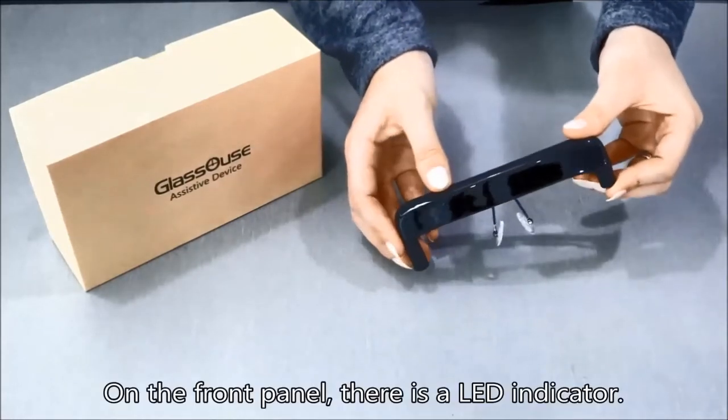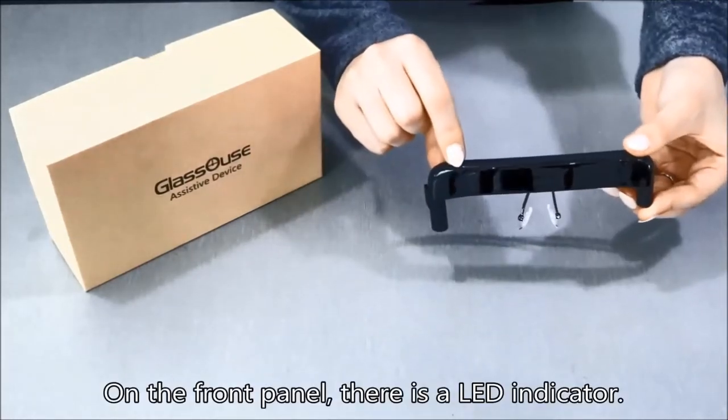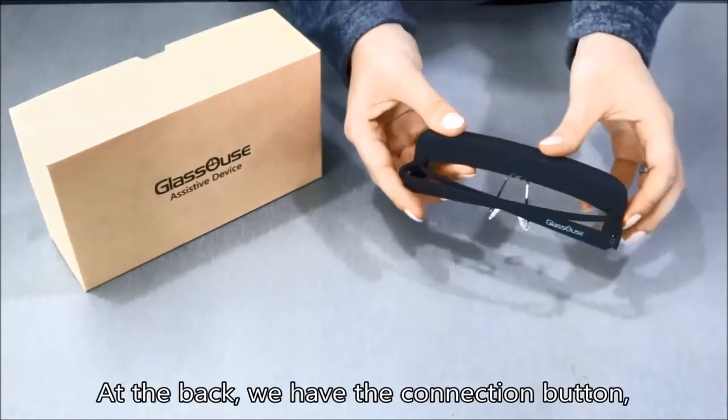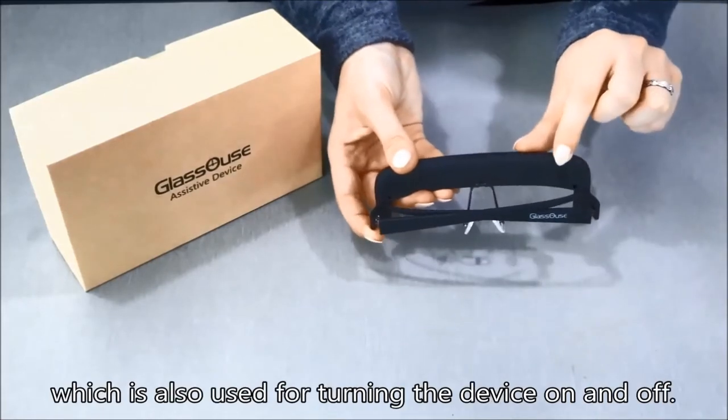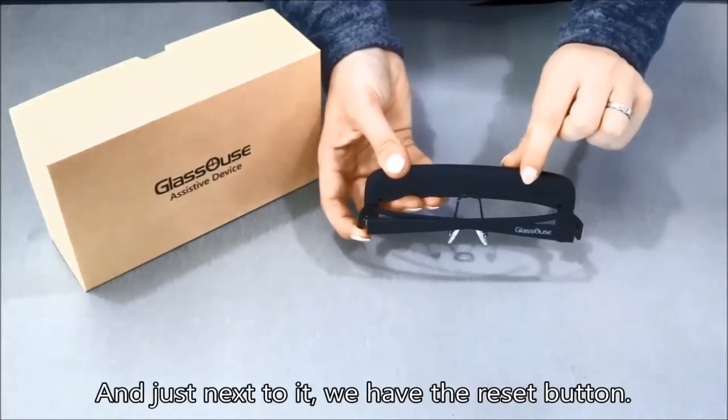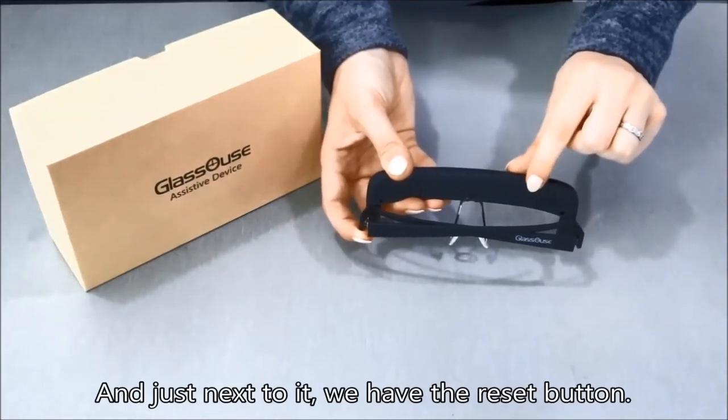On the front panel there is an LED indicator. At the back we have the connection button, which is also used for turning the device on and off. And just next to it we have the reset button.